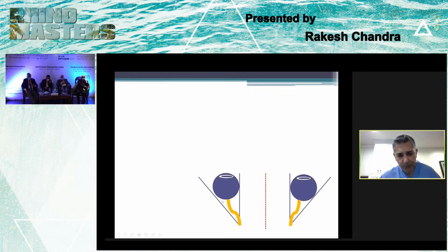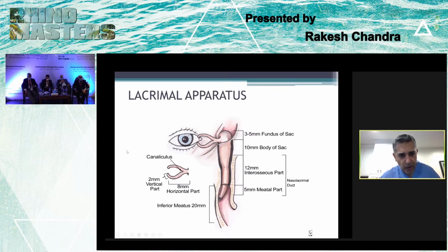There's also some globe, obviously, and then the optic nerve. There is some physiologic tortuosity to the optic nerve itself, and in the posterior aspect of the medial orbital wall, where it transitions to the optic canal, this bone here is often part of a dissection when needed to do optic nerve decompression. So I'm going to start talking about the lacrimal system and dacryocystorhinostomy, and then we'll move through some of the other procedures, including the various forms of decompression.